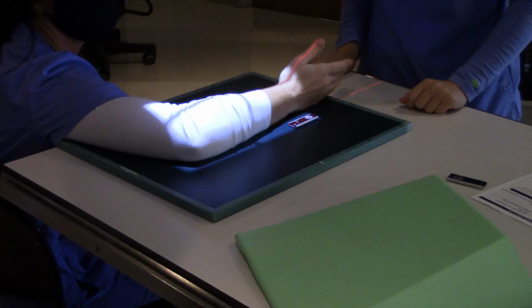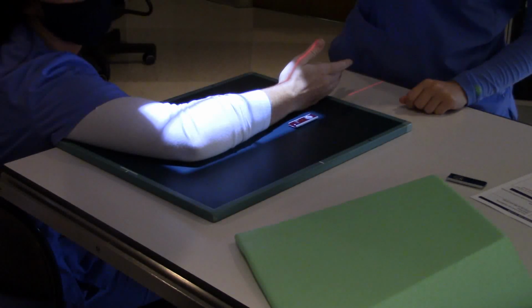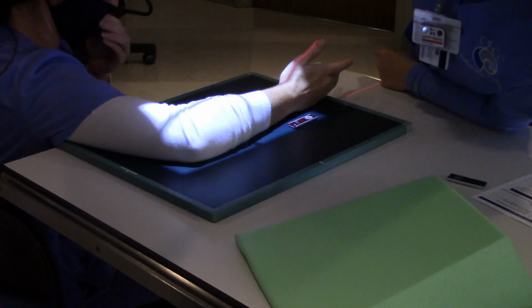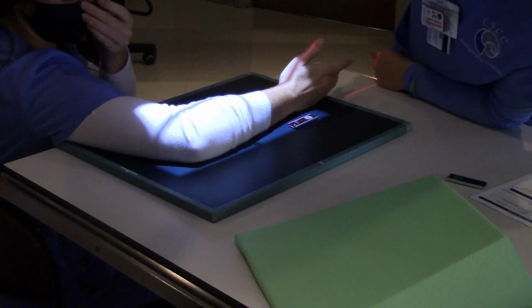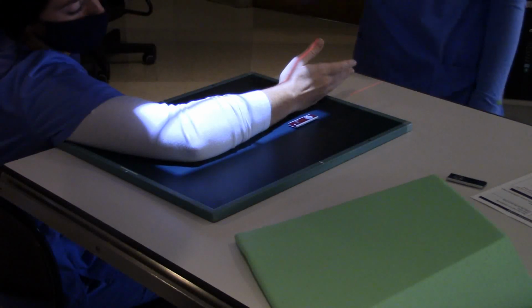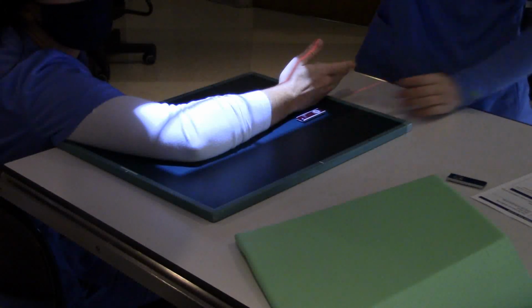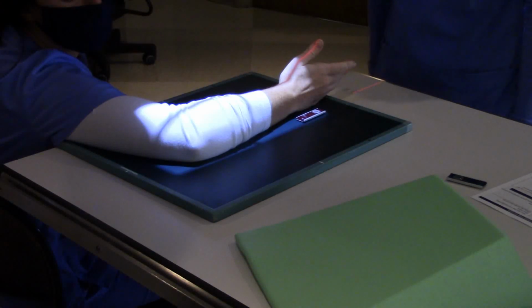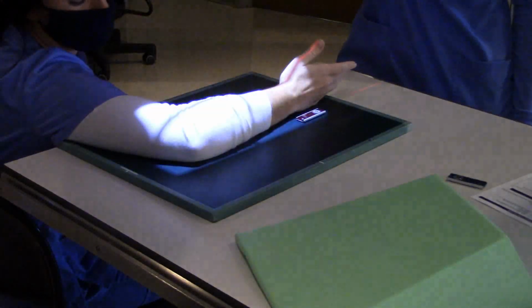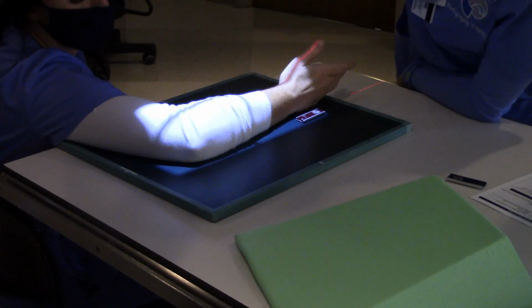Oh, you're cutting it close. I mean, I'm all about some tight collimation. But we better just pray that our light field collimator is dead on. Is that good? I don't know, what do you think? I think you need to open up side to side just a little more.